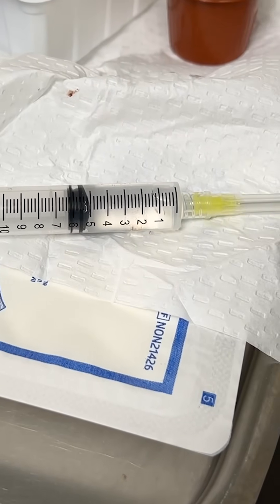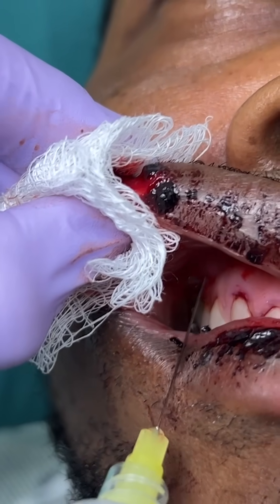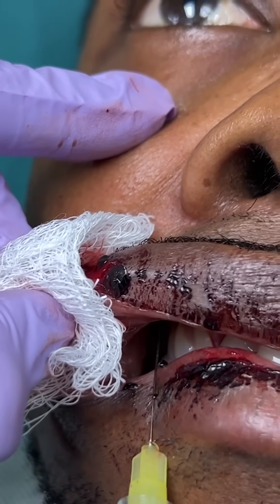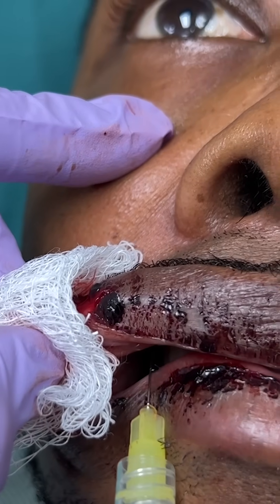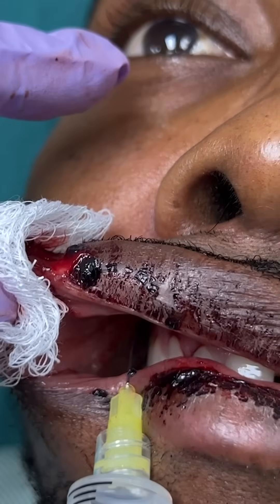Using a 25-27 gauge 1.5-inch needle, insert it through the mucosa of the second premolar — that's the fifth tooth over — and aim up to the foramen, which is about 2 centimeters from the mucosa. Aspirate and inject 2-3 mLs of local anesthetic.